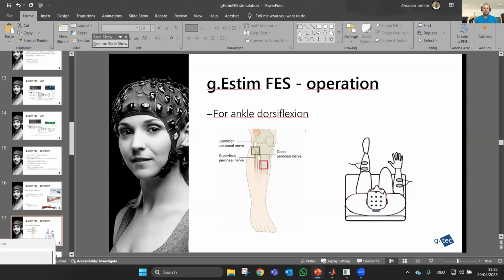When we do the recordings, the main problematic points could be that people have a lot of hair, then you might need to remove the hair if you do regular treatments, for example, with patients. But typically that's also not really a big problem. We had cases when you use it for a longer time, and also with high currents, that you might have a little bit of an issue on the skin, so that it's getting red, or maybe even a little bit, not really burnt, but simply a little bit irritated.